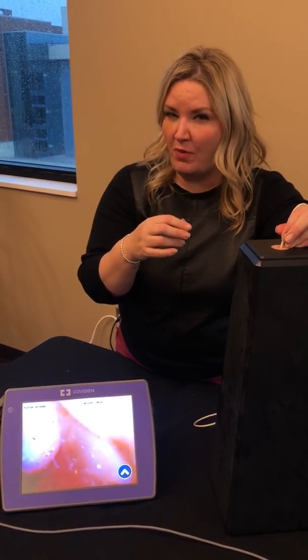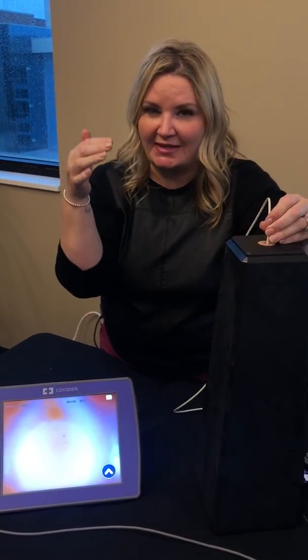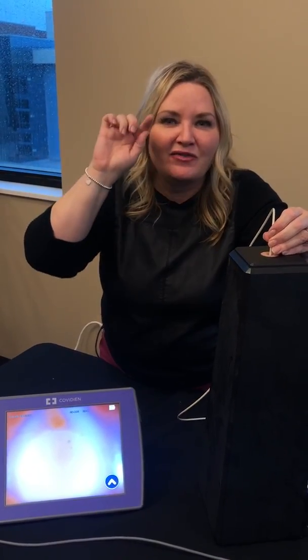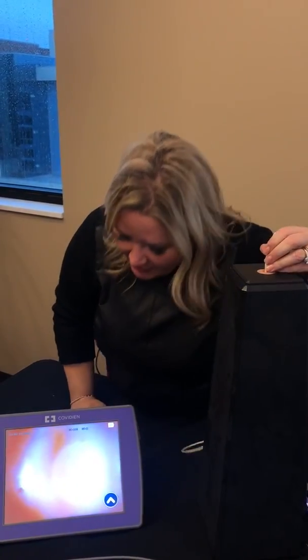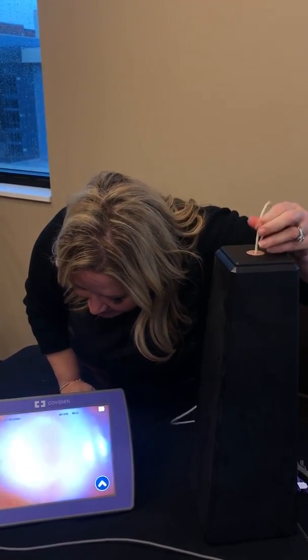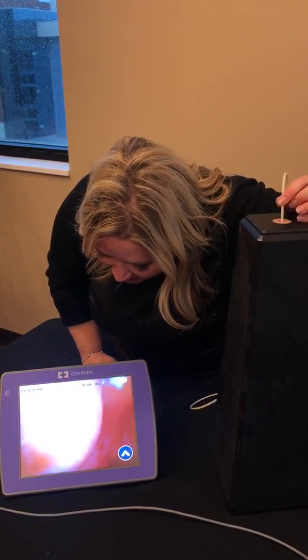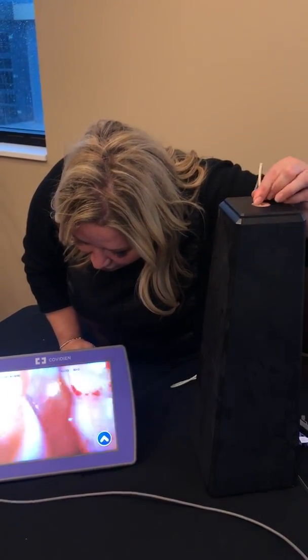So let's say we want to go post-pylorus. We'll keep advancing until we see, basically, little villi. You might see some bile and more smooth muscle. So you'll see the muscular composition of the tissue change as we get post-pylorus. I think I keep getting stuck in here, but this is what happens when you use a model. Let's try this again. I'll pull back, and now I'm going to see if I can advance post-pylorus.